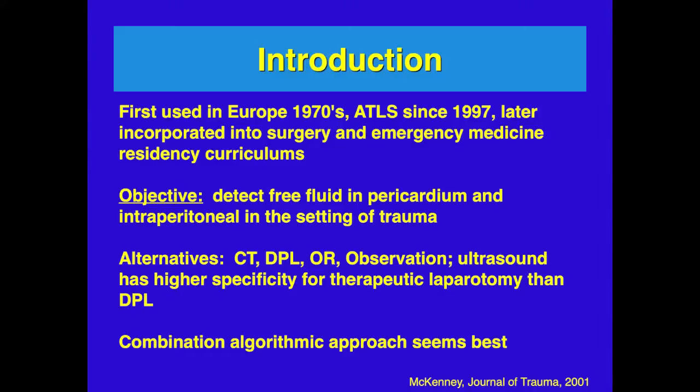It's a non-invasive way. Its alternatives include CAT scan, diagnostic peritoneal lavage, going straight to the operating room, or observation. But ultrasound has a higher specificity for therapeutic laparotomy than diagnostic peritoneal lavage. Probably a combination algorithmic approach seems the best.